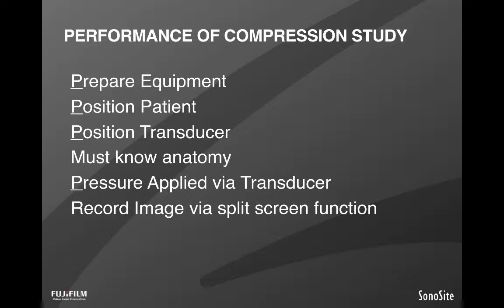So for me, using the P's, first is get your equipment, prepare them. Position is very important. Know how to hold and position your transducer. We're going to go over the anatomy again, not only using the anatomical cartoon, but as well as learning how the different branches look on ultrasound, and then know how to apply pressure, right? Recording image, you can do it a number of ways. Split screen is not the only one, but we'll go over it.